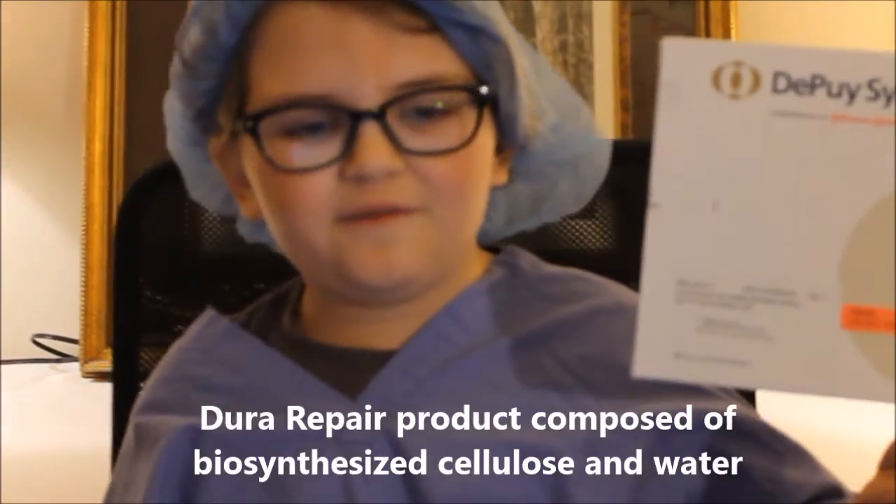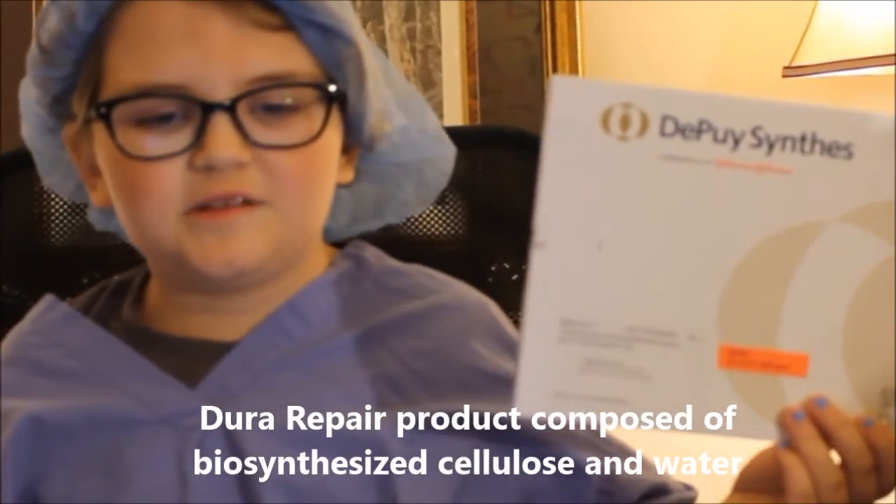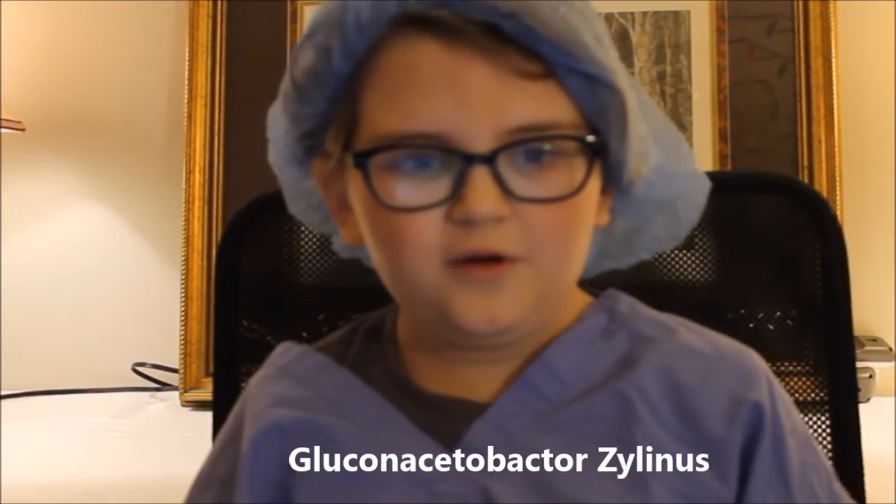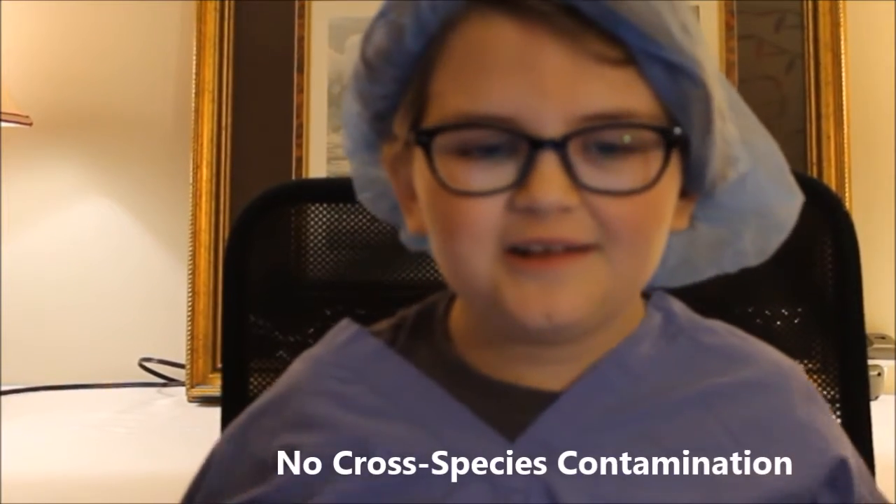Hi guys, it's Dr. G here today and I'm here to tell you about a new product from DePuy Synthes called Synthecel. Synthecel is a dural repair product that is composed of naturally formed biosynthesized cellulose and water. Its interconnected cellulose fibers are naturally formed by Gluconacetobacter xylinus bacteria. It is purely plant-based, so no cross-species contamination is possible.